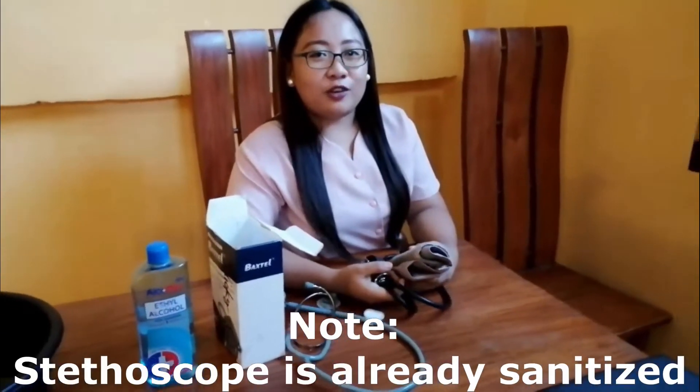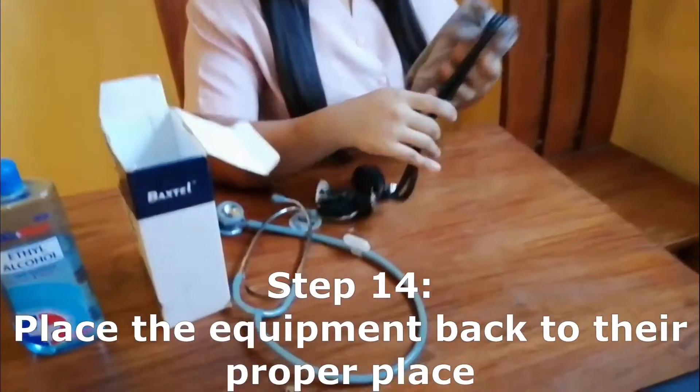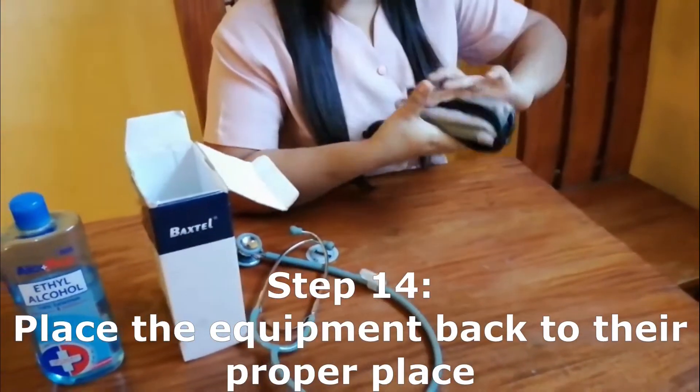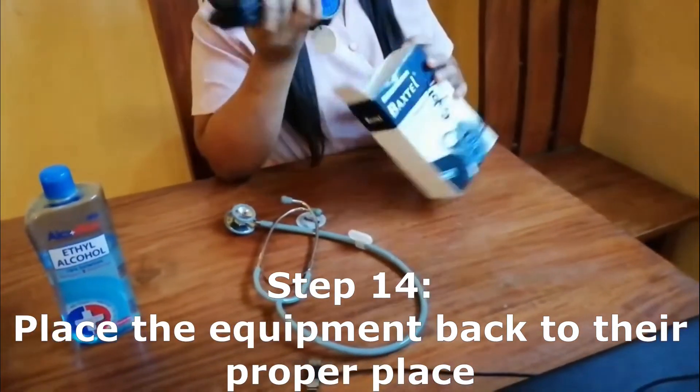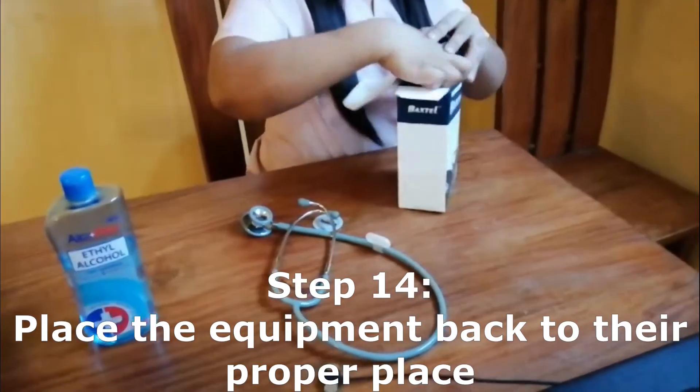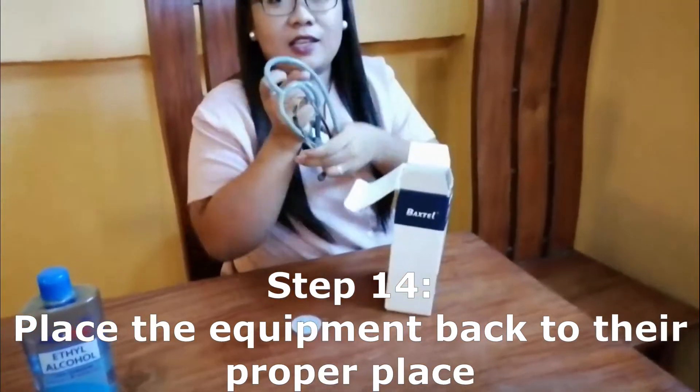If you are done measuring your client's blood pressure, place all the equipment back in the box. Be sure that it is placed properly.